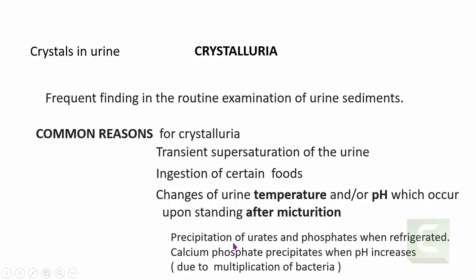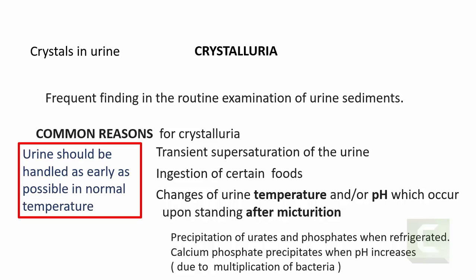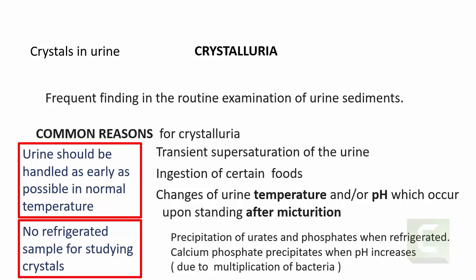For example, you can see precipitation of urates and phosphates, particularly when the sample is refrigerated. There can be precipitation of calcium phosphates when the pH increases — for instance, in suspected urinary tract infection, bacteria in the urine multiply, causing an increase in pH and calcium phosphate precipitation. Urine examination should be done as early as possible after collection, at a temperature close to body temperature. Never study crystals in a refrigerated sample.